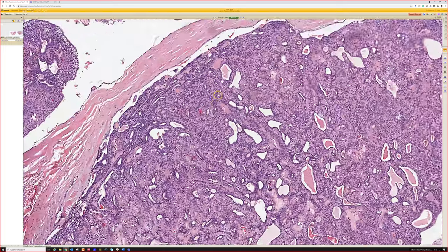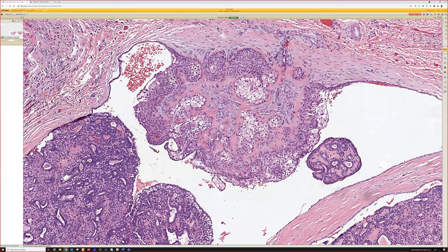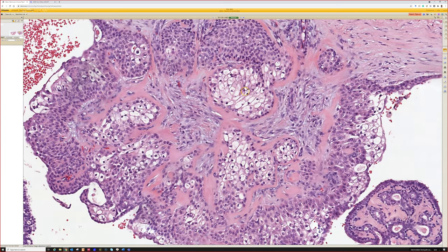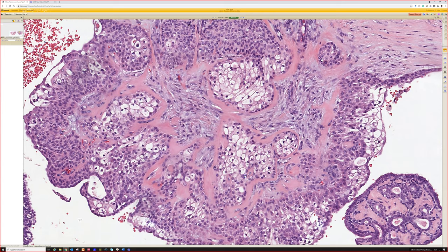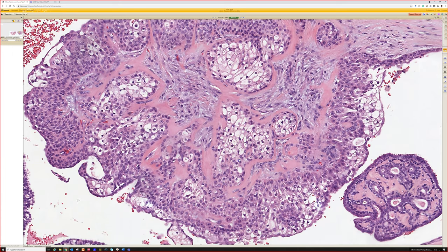Hidradenoma can have a wide range of appearances, and I always like to say if you see something that you think is a sweat gland tumor, but you don't know how to classify it, and it's a test, guess hidradenoma or guess mixed tumor, because both of those are relatively common and have a wide range of different features. And then here's a nice example of the clear cell change from glycogen-filled cells, and sometimes you can have dramatic clearing of all the cells, and it can really closely mimic renal cell carcinoma.